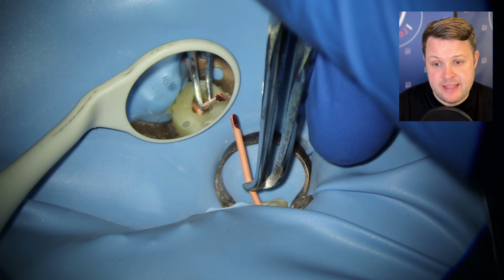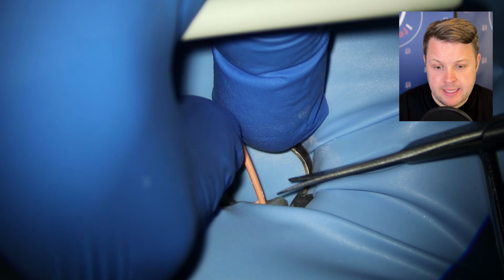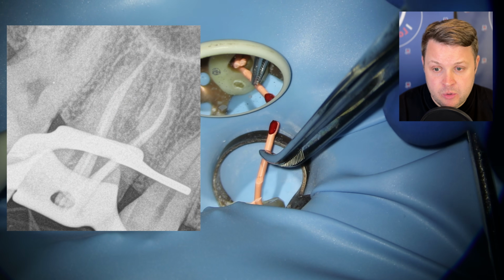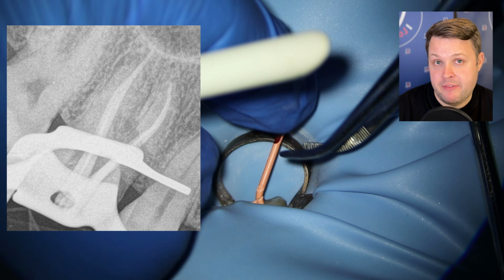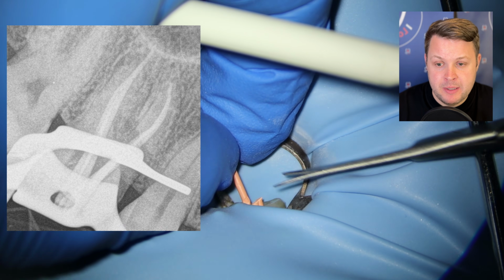And you can see here that now when we push this GP cone to length after reshaping the canal, it fits nicely to length. Then we have a look at our cone fit radiograph, and we can see that all of the cones are fitting really nicely to within the radiographic apex, or the acceptable level of the radiographic apex. I also want you to focus your attention on the palatal here.